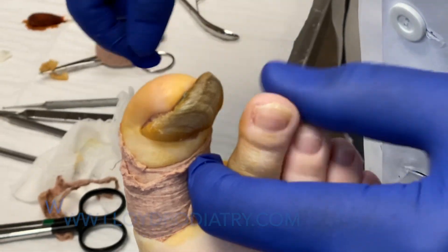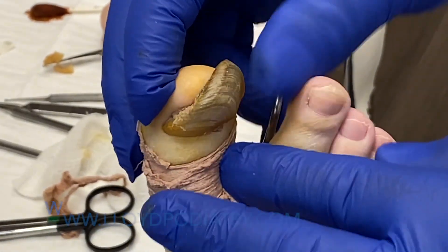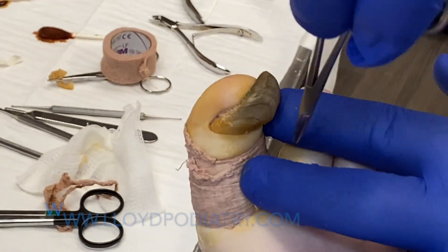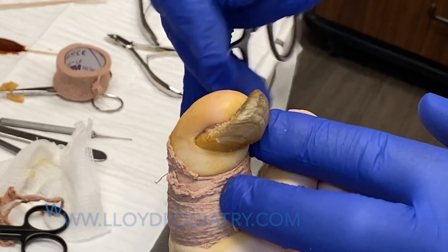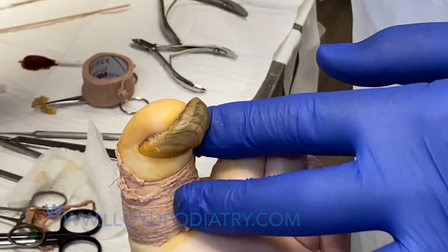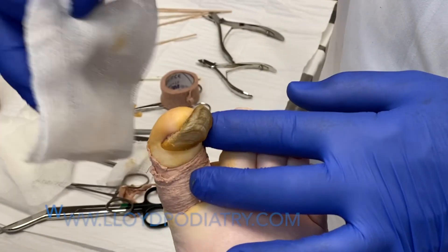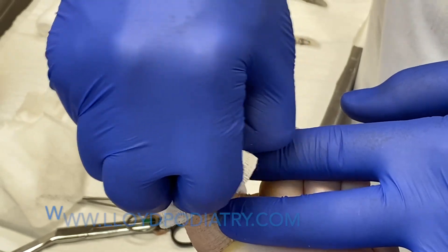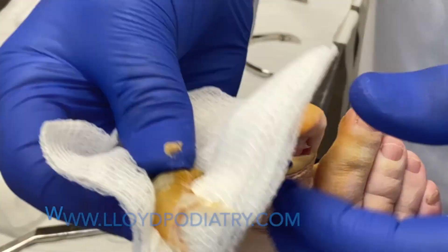So here you can see this nail again. Most people would come and kind of cut on the sides or cut back here. I find that one of the easiest ways to do it is just use the toe as a little bit of a lever, and you can say abracadabra, and the nail is gone.